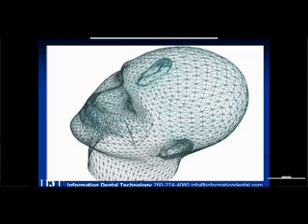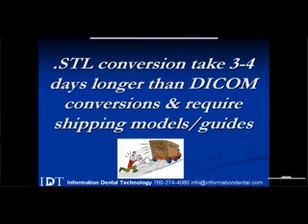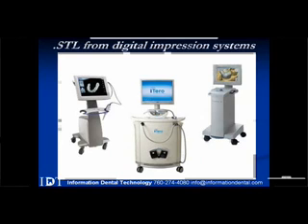We have a fair amount of people using it, but not that many because you can't use it on every case. And it does require shipping and things like that. So it takes a few more days for us to do the conversion and send it out.